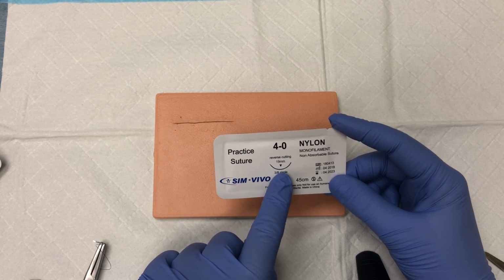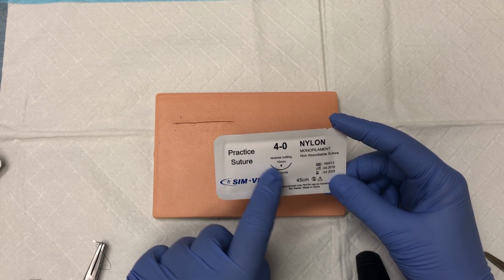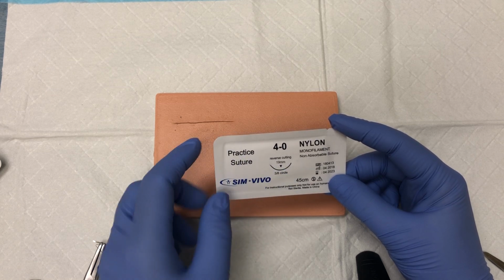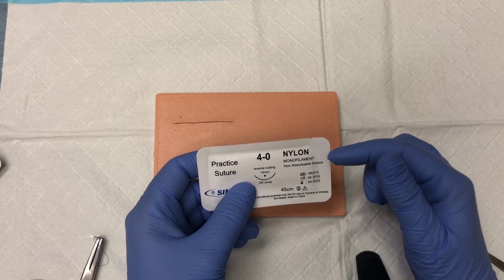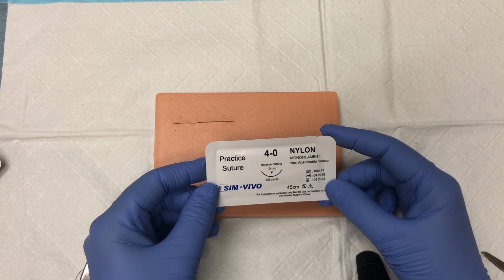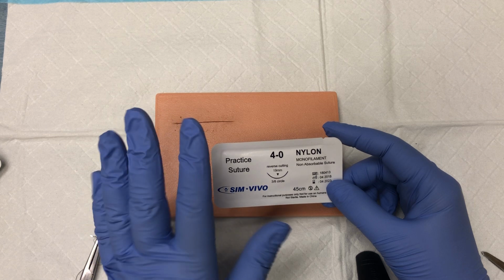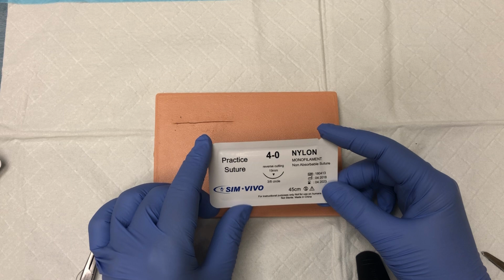It's 19 millimeters and actually gives you an image of the needle itself in terms of the overall curvature of the needle, but also gives you an image of, if you were to look down the shaft of the needle, what it would look like. It also tells you it's 3/8 inch in terms of, or 3/8 of a circle. It's nylon, it's monofilament, it's non-absorbable, and it's 45 centimeters in length. So most of your sutures come between 18, 30, and 45 centimeters in length. That's very common lengths, whether you're talking operating room, urgent care, or emergency department.